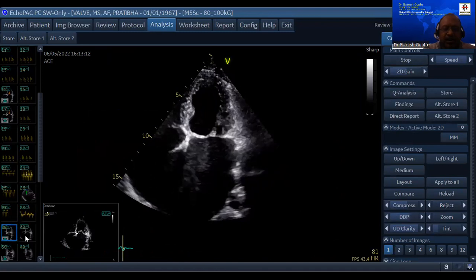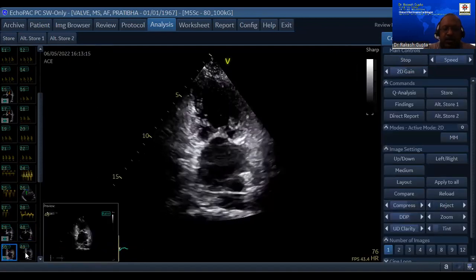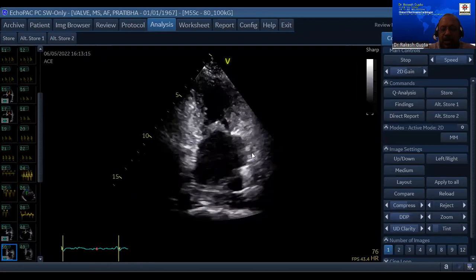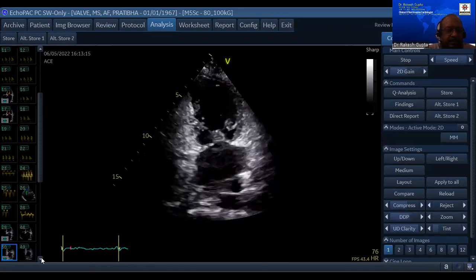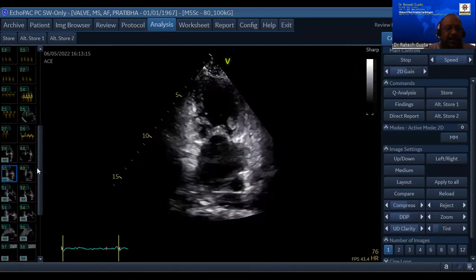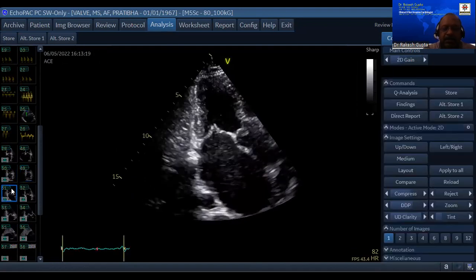And whenever you see all this, we measure the annulus. This is again not at your levels. Annulus in 4 chamber and 2 chambers. And then this is the atrial appendage. We try to look at the atrial appendages, because when we have a contrast here, this is the annulus measurement at 2 chamber level. 3 chamber LV functions.